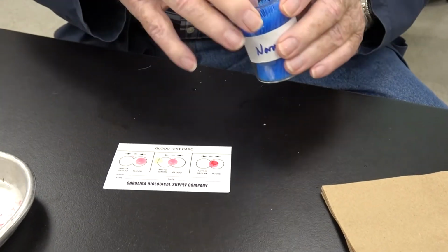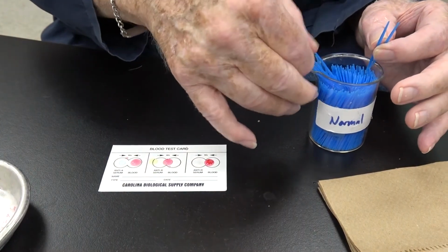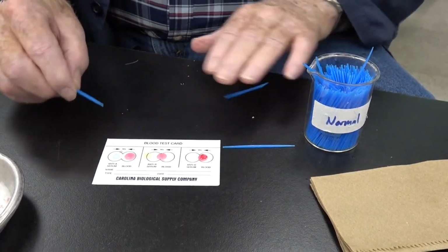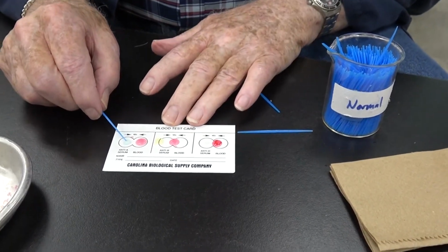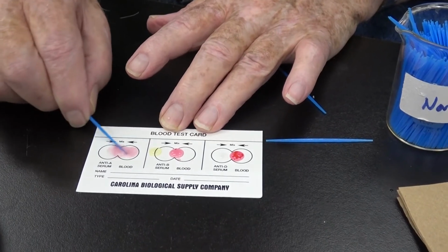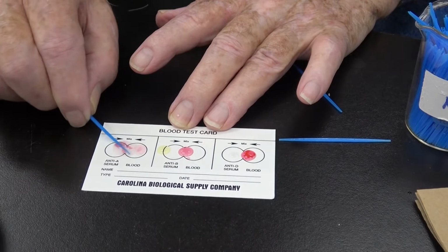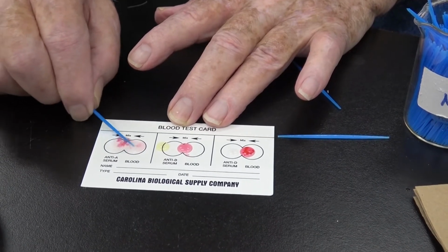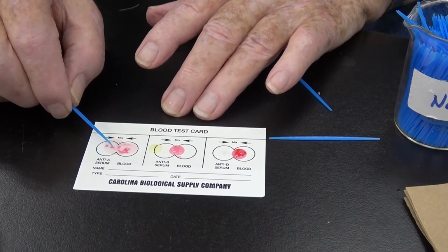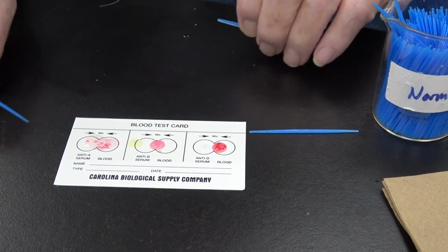We take toothpicks. We get 3 different toothpicks. And we stir them very carefully. Don't flick it. Stir it very carefully. Like this. And you see it, if it starts to coagulate, like you see it doing right here, that means it's got the A antigen. So that would be that one.